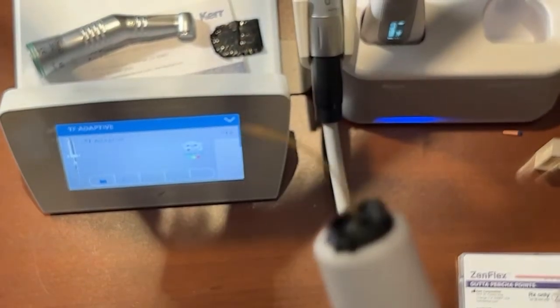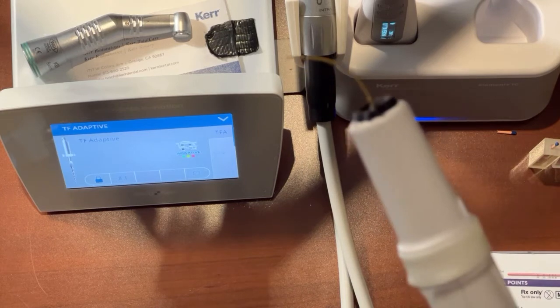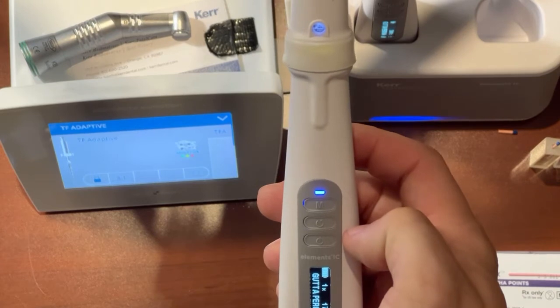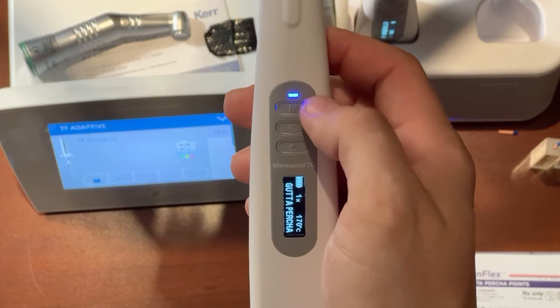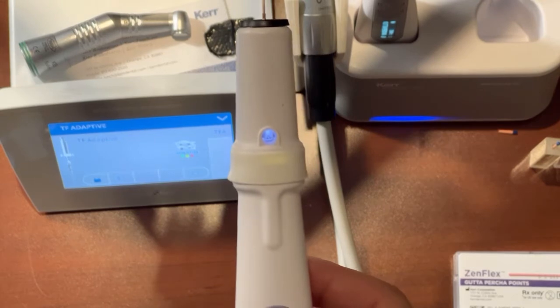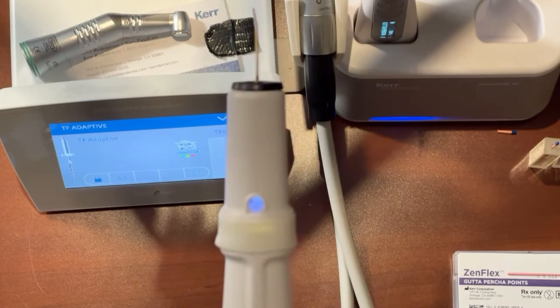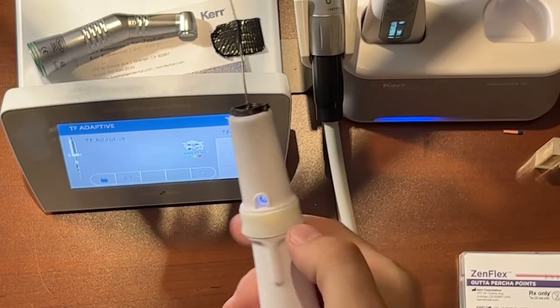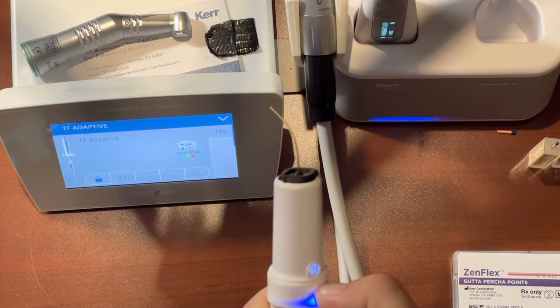Let me see if I can zoom in for us. So you see that there, very flexible. So you'll pre-bend that tip. And while it's heating, there we go. Now with the solid blue light, that means that we are hot. We're ready to go. It also has an indicator right here showing you how much gutta percha is left. It counts down 4, 3, 2, and 1 so that you know exactly how many canals you can fill. So what we're going to do is prime the needle.